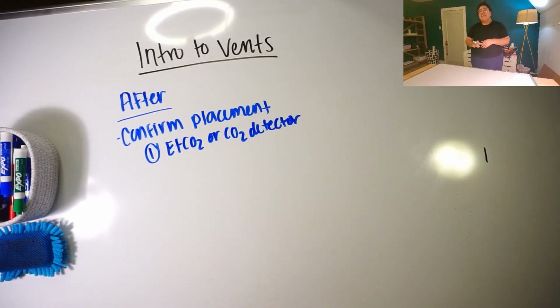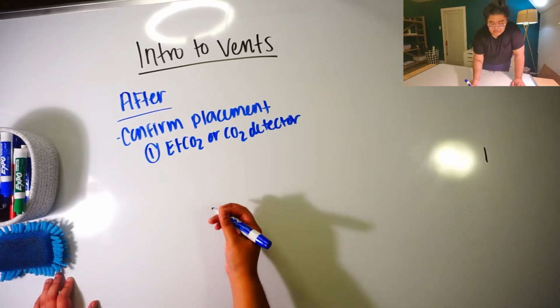You will know if you're in the esophagus also because you're going to be blowing a bunch of air into their bowel, and likely they're going to start producing a bunch of gas. Okay, so end tidal CO2 or CO2 detector.